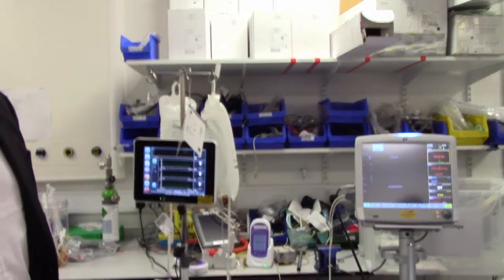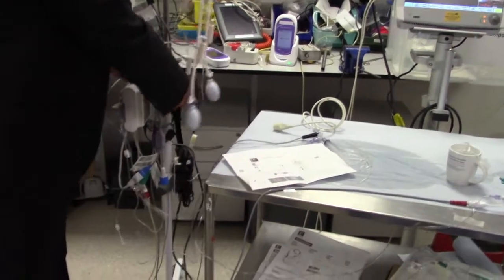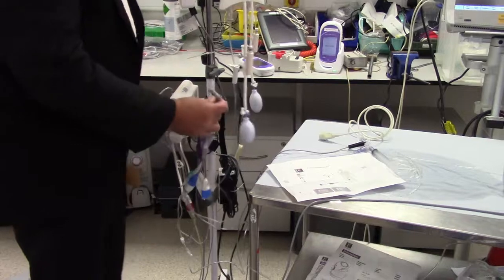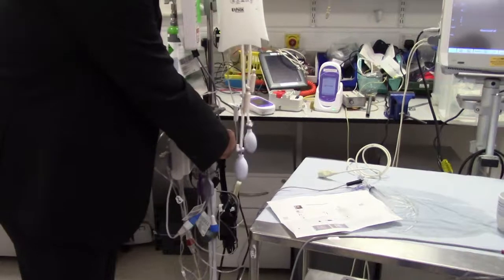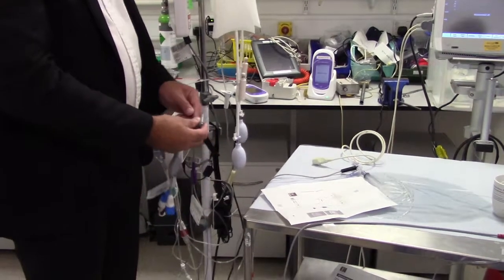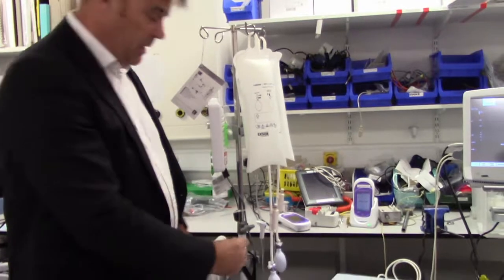So what do you think the problem yesterday was? Is it just a misconnection? If there's likely to be a problem, it could be this. But that isn't the case, because there was nothing wrong with that. Is there a way of getting at the problem we did see by some other means? Has that been taken out and removed a couple of times? It actually can be that. There have been times when just removing that connection improves the contact and clears the problem. So that could have been the problem.